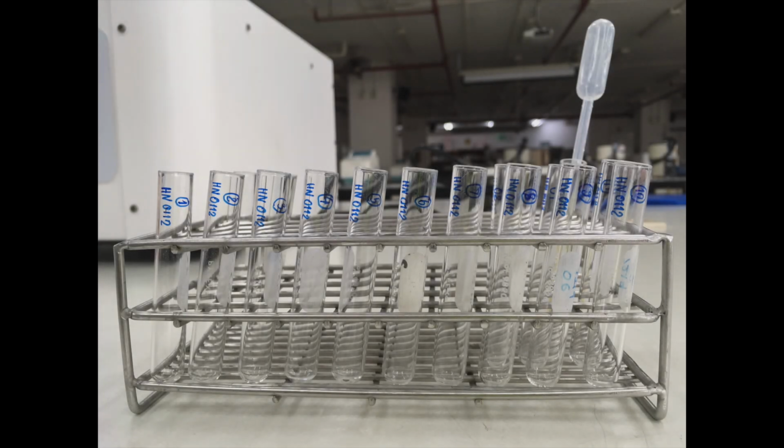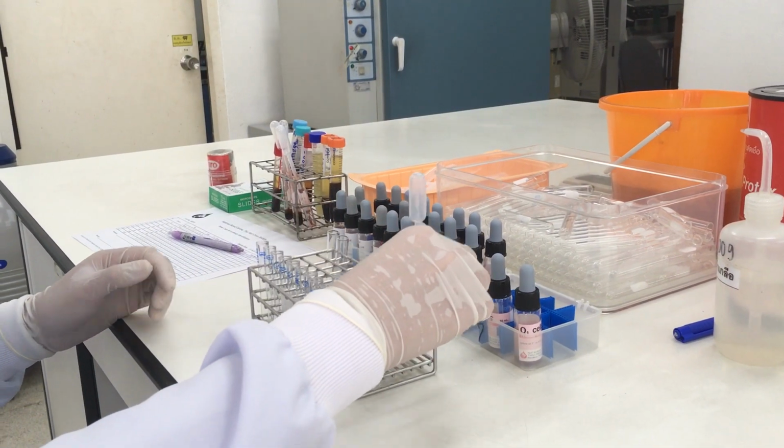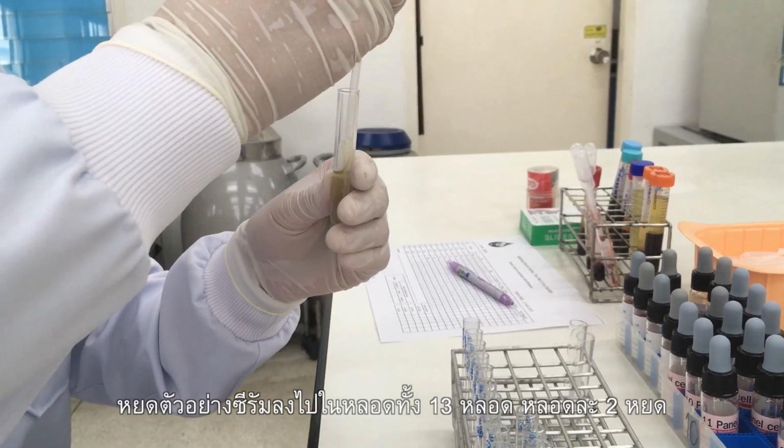Antibody identification. Prepare 13 clean and dry test tubes. Label the first 11 tubes as 1 to 11 and the last 2 tubes as O1 and O2. Transfer 2 drops of serum into each tube.